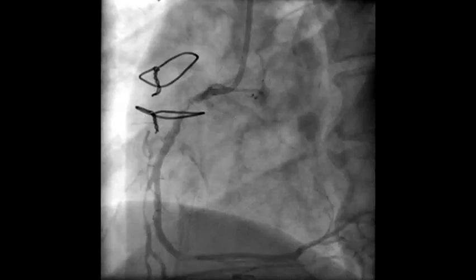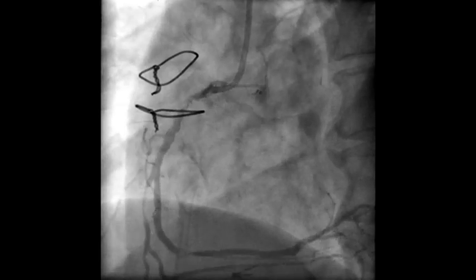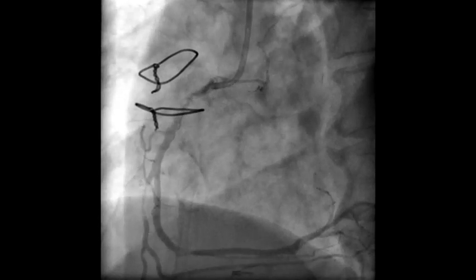His LIMA to LAD is patent. Here you can see the diagnostic angiogram of the RCA showing the proximal RCA lesion which is around 70%, short and discrete. You can also see another short and discrete lesion in the mid-RCA which is around 90%. This is an AR2 guide catheter 7 French with a whisper wire being parked distally.